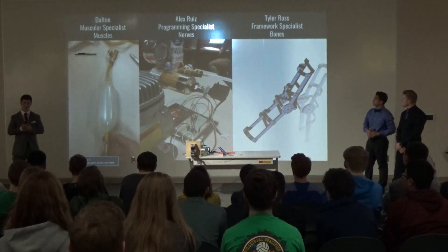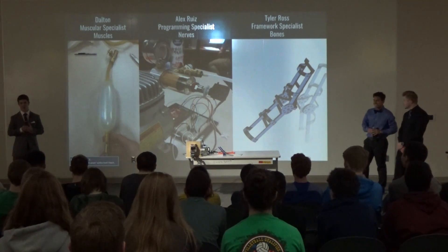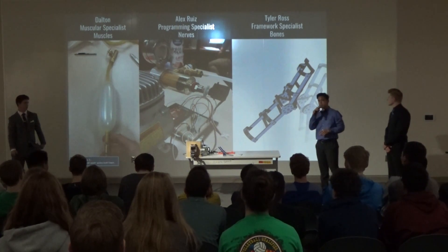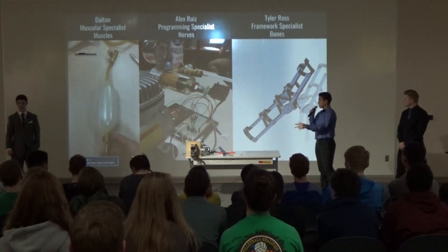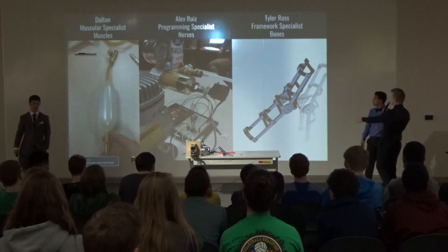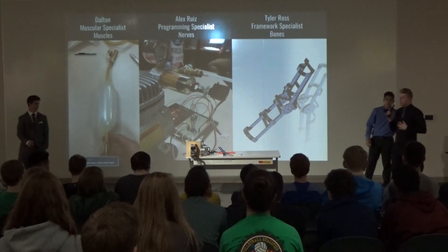I'm the muscular specialist for the project. I focus on the pneumatic muscles, increasing the strength and functionality. I'm the programming specialist — flex sensors, servos, that whole aspect of the project. And I do all the framework, which is mostly SOLIDWORKS, as you can see here. That's the fully assembled first one. I do all the SOLIDWORKS stuff.